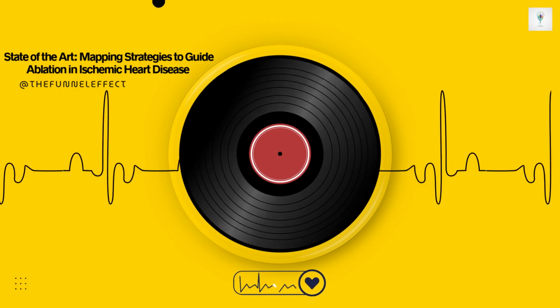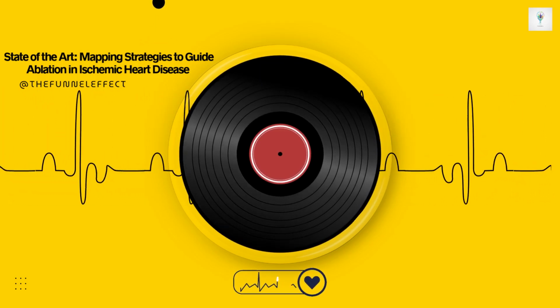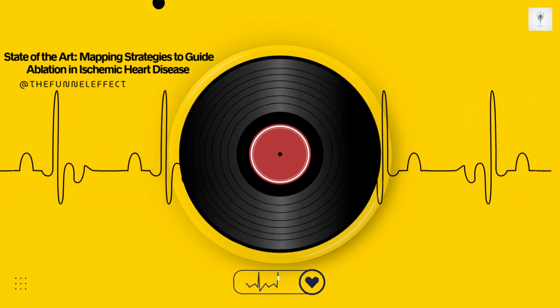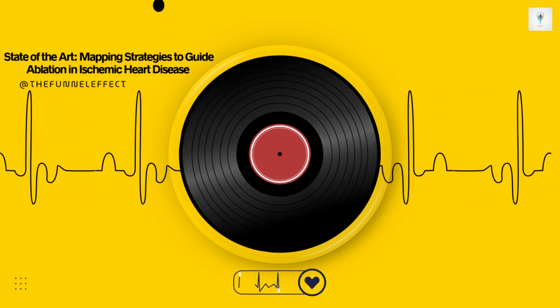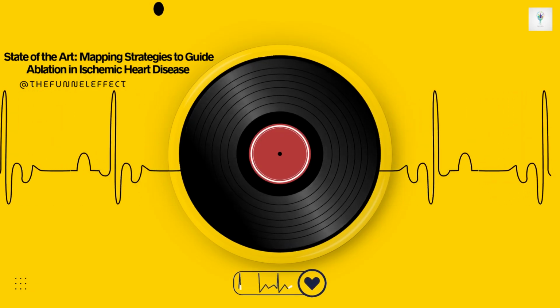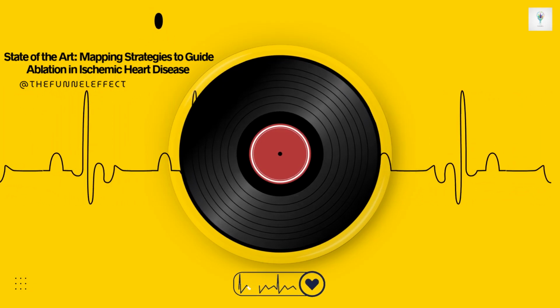These are signals that look really messy. Multiple sharp, spiky components, often following a smoother, rounded initial signal which might be far-field noise. The theory is that these complex high-frequency spikes represent the electrical wavefront breaking up or colliding as it enters or exits the narrow confines of a channel within the scar. So the shape suggests proximity to an entrance or exit.